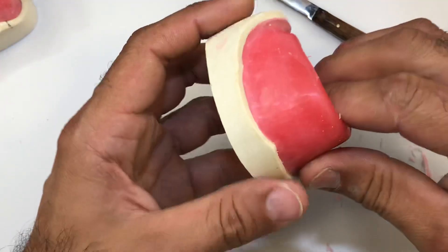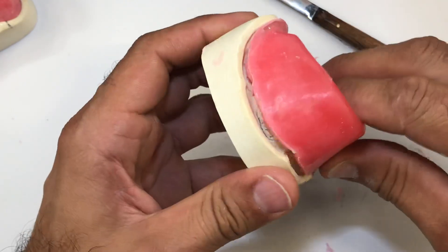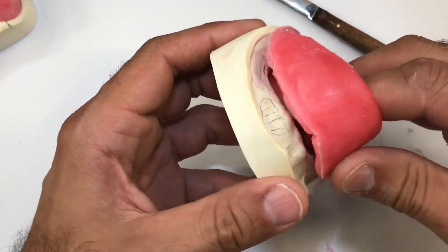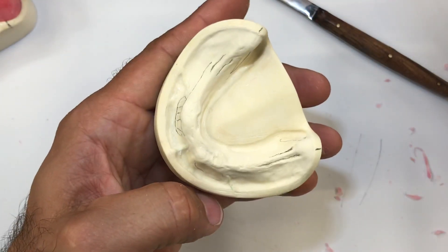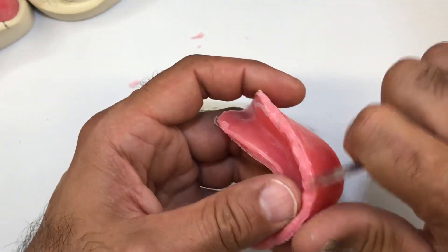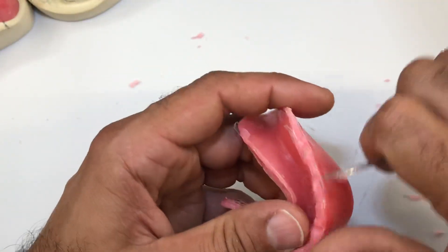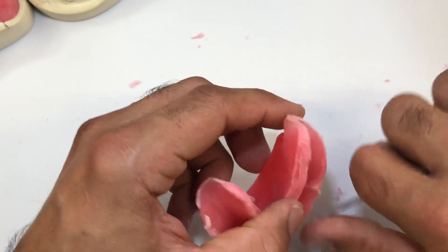Let's just see if we can pull this out. Grabbing it, and it really shouldn't have any problems unless you have very severe undercuts. Gently — nothing is left on the cast. And once again, I'm going to carve the excess wax away from the periphery.